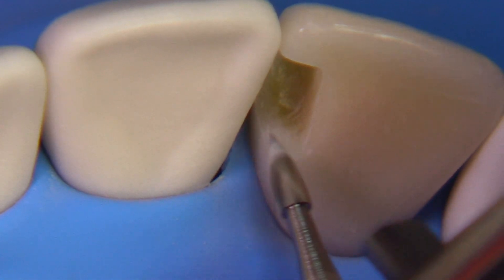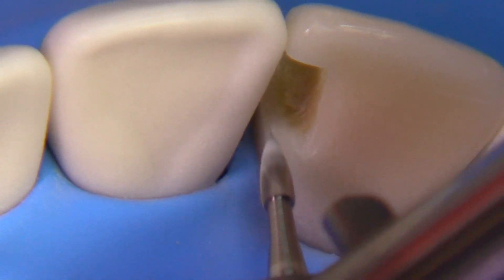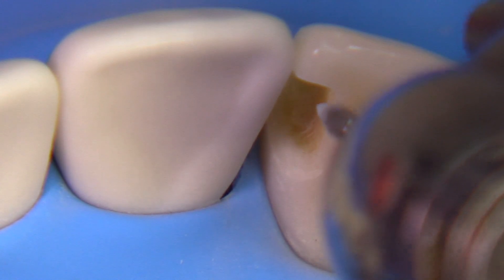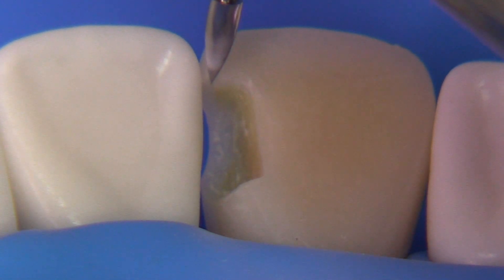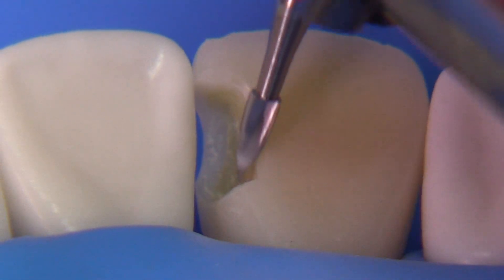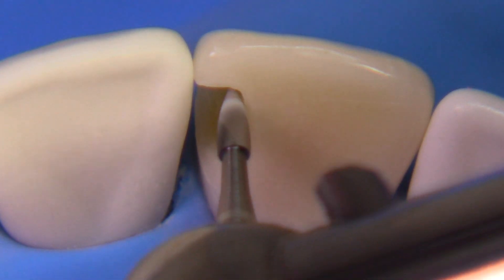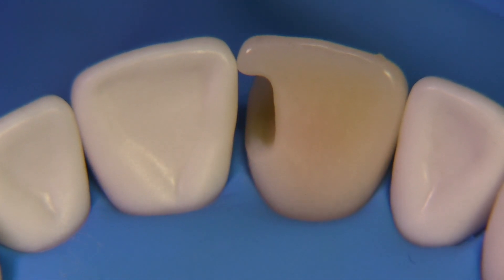Probably 45 degrees would be fine for the bevel, but my favorite way to describe it is that a bevel is a change in direction of the wall. It doesn't necessarily have to be 45 or 60 degrees — just make sure it's an obvious change in direction and make it look clear so the examiners and graders know what you are doing. Don't make it haphazard. I would not do a starburst bevel on this case — there's no reason to do any of the aesthetic blending procedures here.